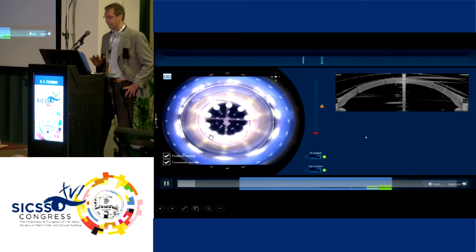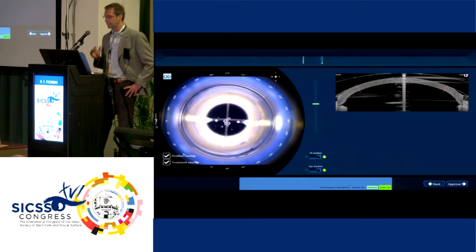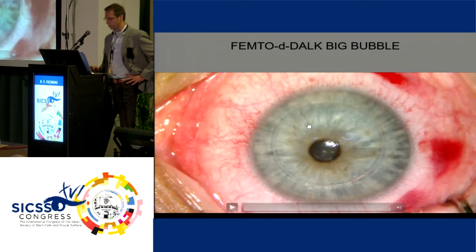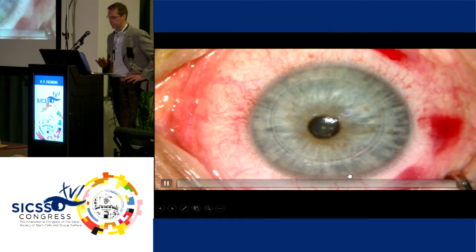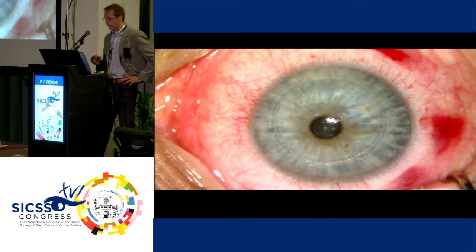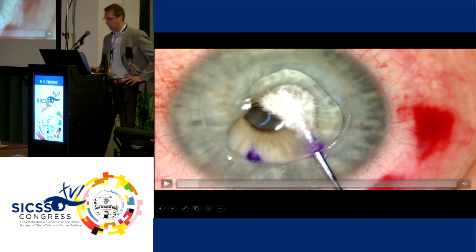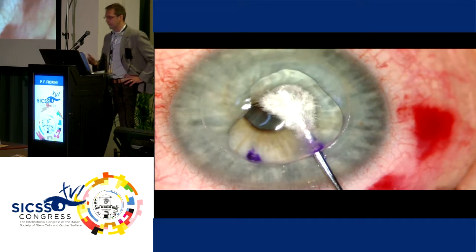Then the donor should receive the same treatment, and with the femto laser we create a full thickness treatment, of course. And at last, we get to the eye. Here we have a perfect cut, quite well centered. We have two tunnels here, probably more clearly visible at the microscope. We only have to find the tunnel to get into, and then we are already guided at the right depth. The tunnel gets to this point here where I have stained, and then the route is as you like, according to the standard technique.